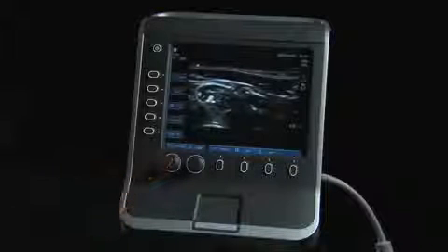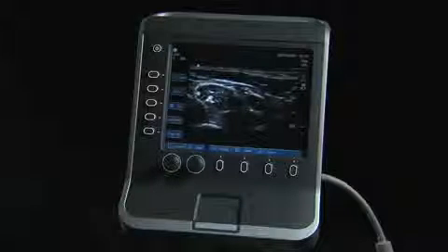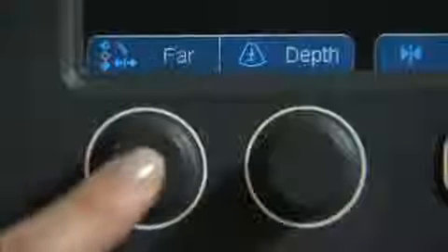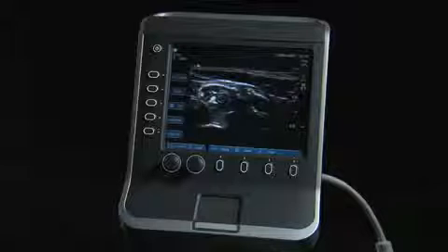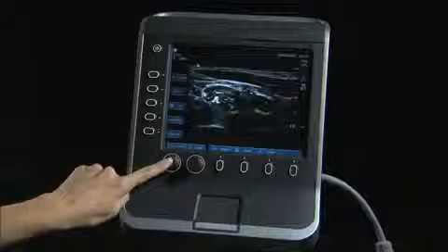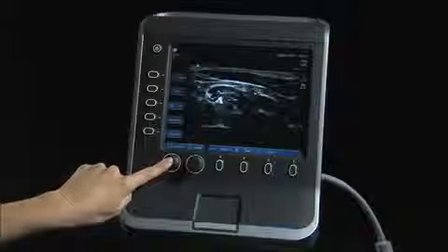The first knob has multiple functions. When the system is in imaging mode, this knob controls the gain levels. There are 3 choices: far, near, and overall gain. The system default is overall gain. To choose another gain setting, push the knob to toggle between the gain settings.